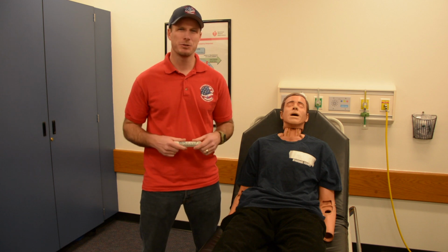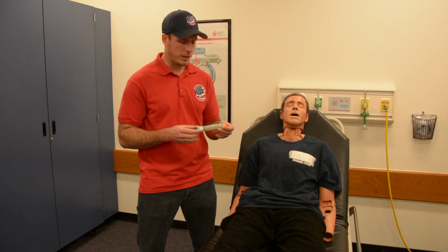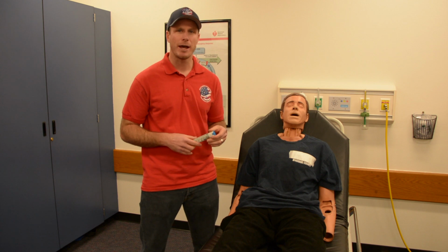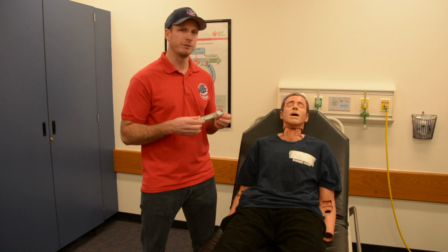My name is Tyler Andrews, and in this video today we're going to be talking about epinephrine and how to administer an EpiPen to our patients. First off, our EpiPens do come in a couple different varieties. Some might be known as your auto-inject, your twin-inject, your EpiPen, but most of them will have similar features.